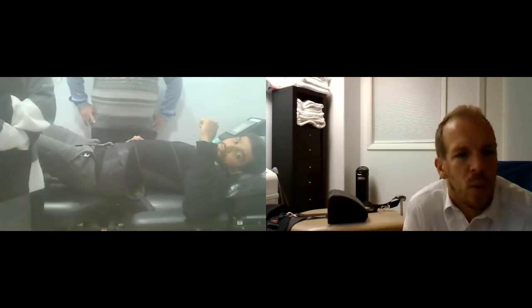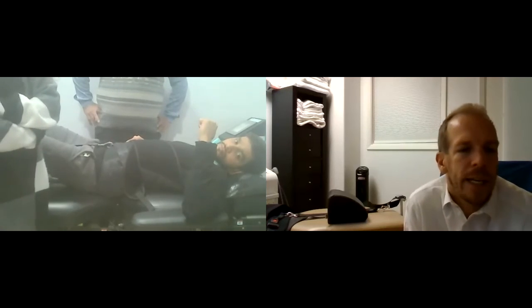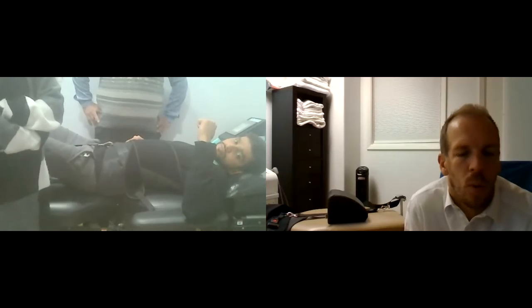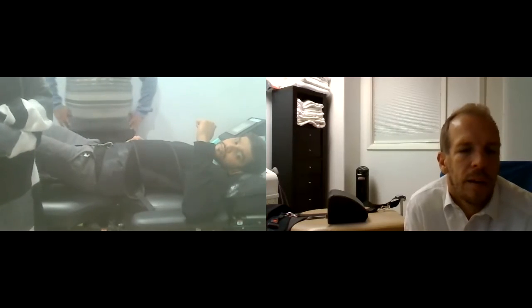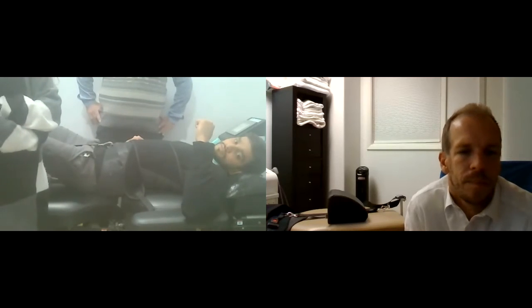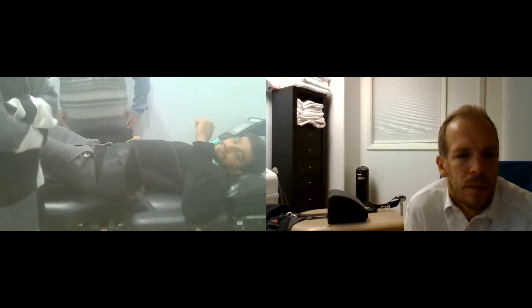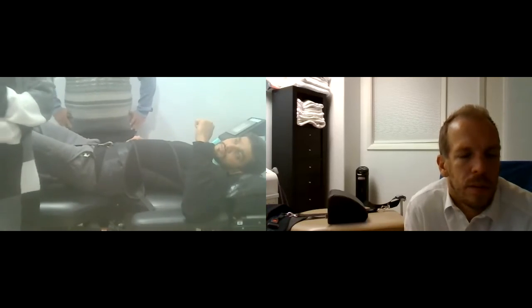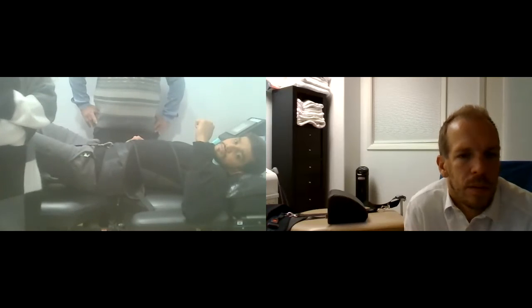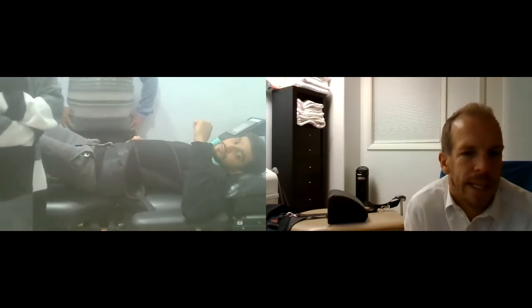Now, if on the first visit they get really sore and they're in a little bit of pain, then you may not just do 1 cycle again, or maybe even less. Just as long as you're not making them sore or worse. If a patient is complaining of any kind of soreness, stiffness or pain, we should not increase the cycles. Correct. And you may want to decrease the force at that point.